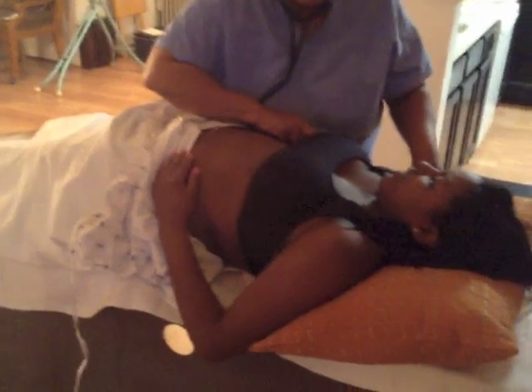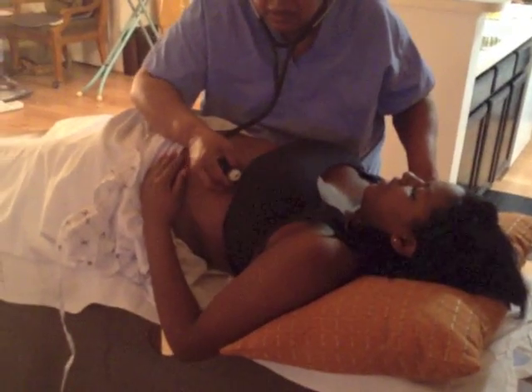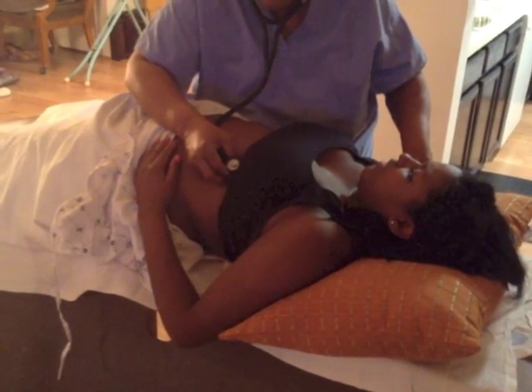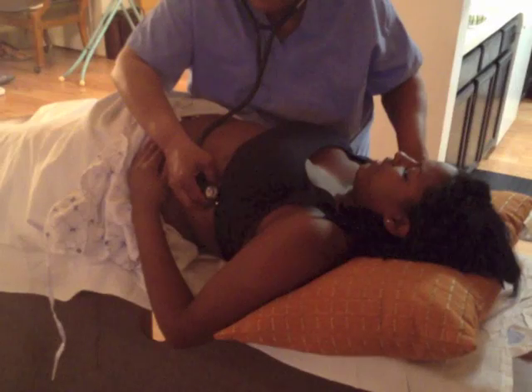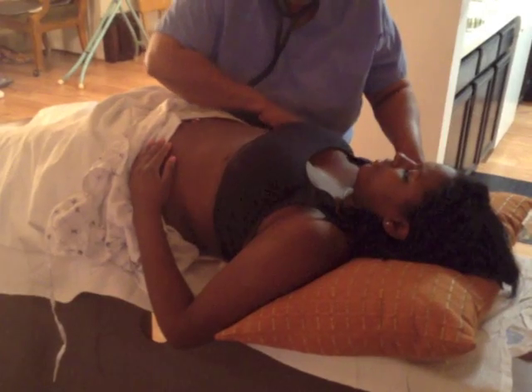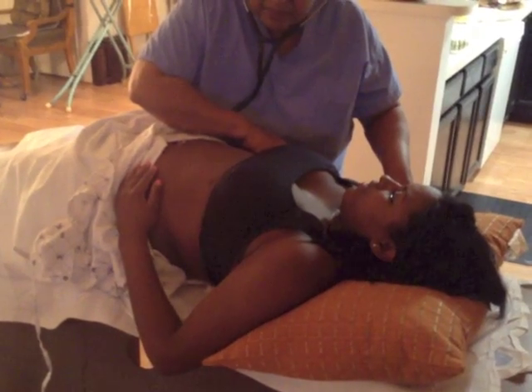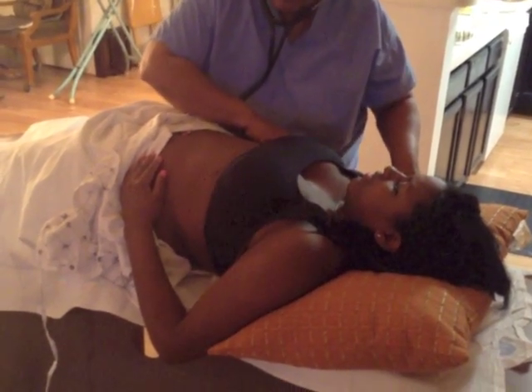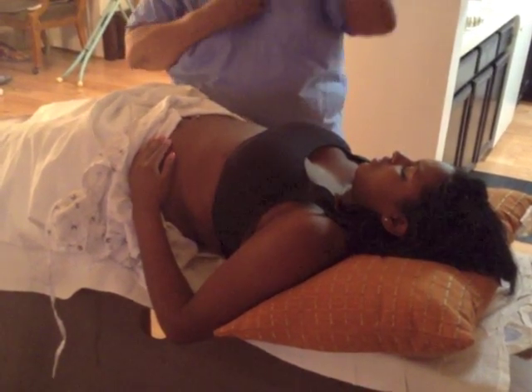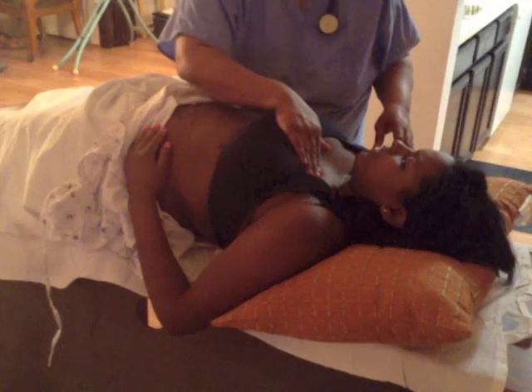You have S1, S2. This will also help me to determine the patient's heart rate. Okay, now I'm going to listen to the aortic valve.